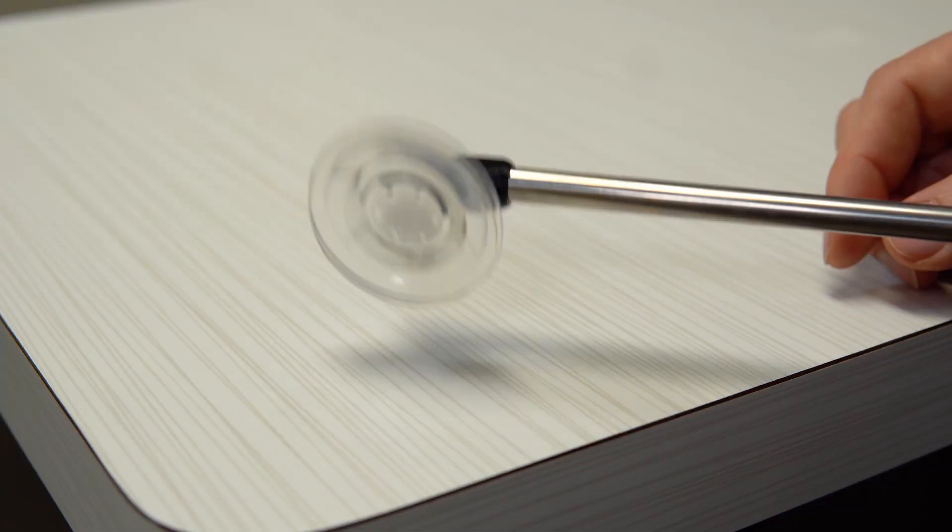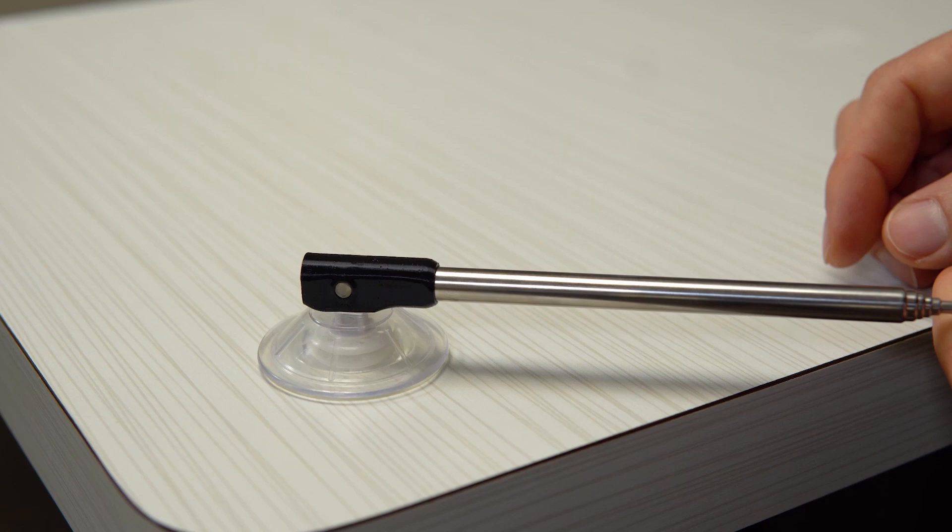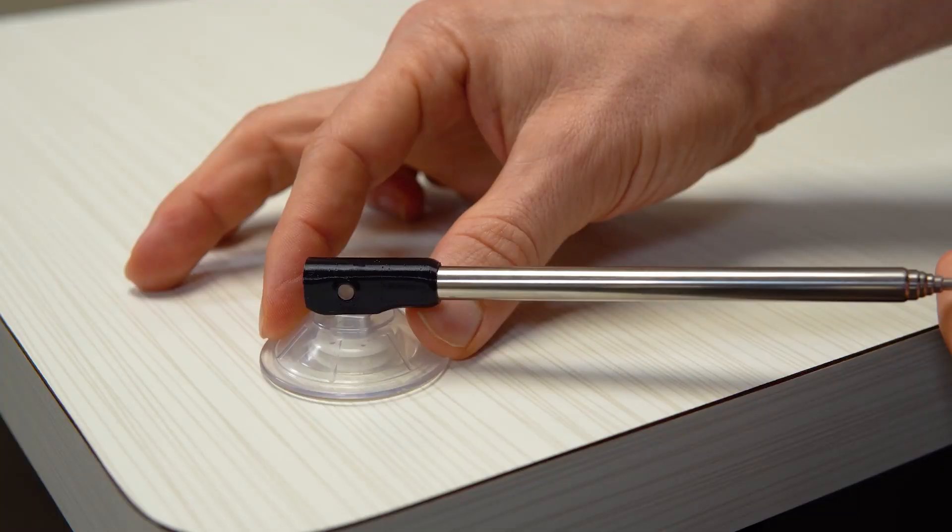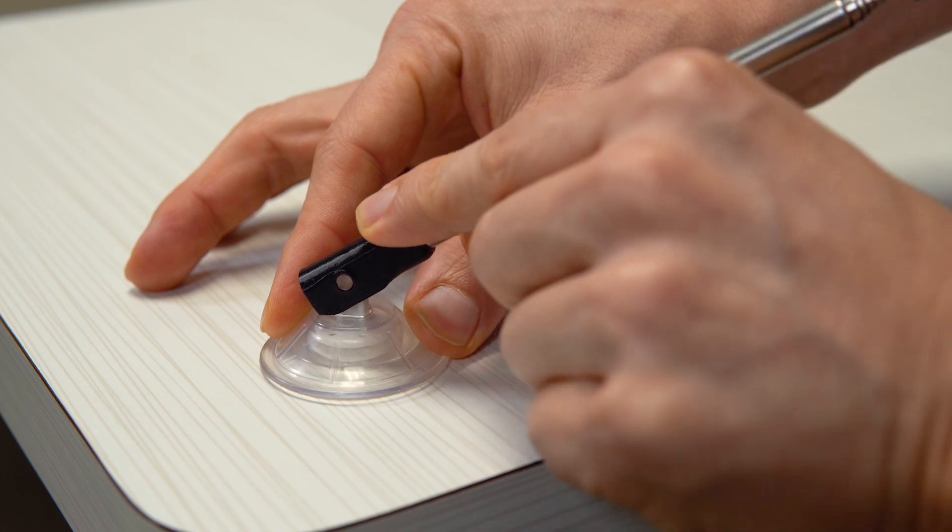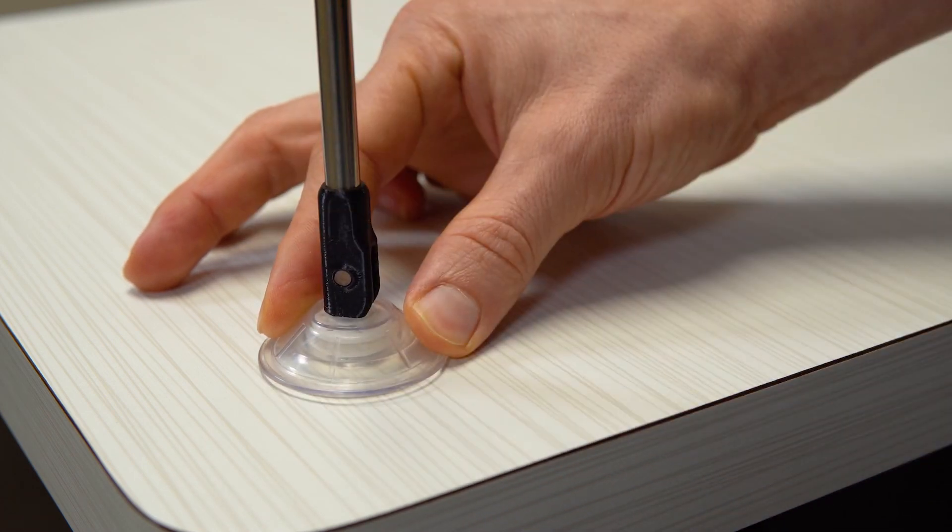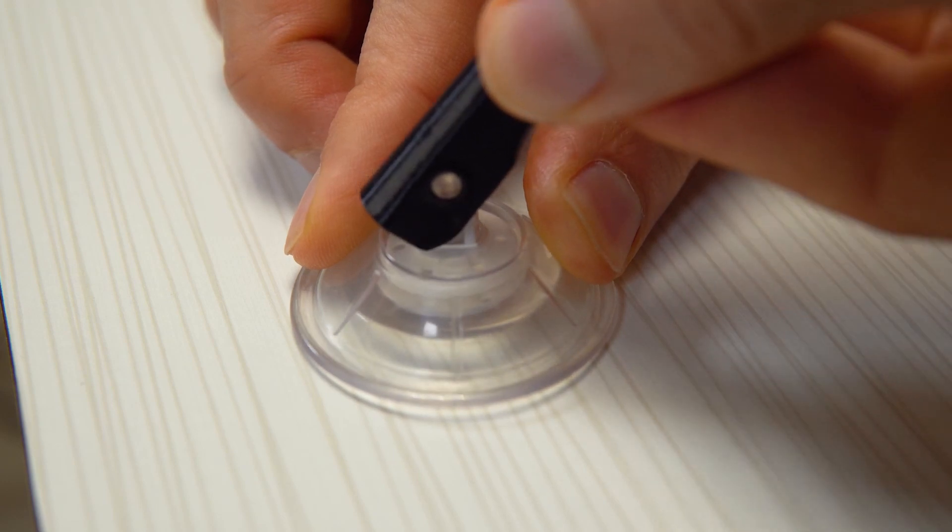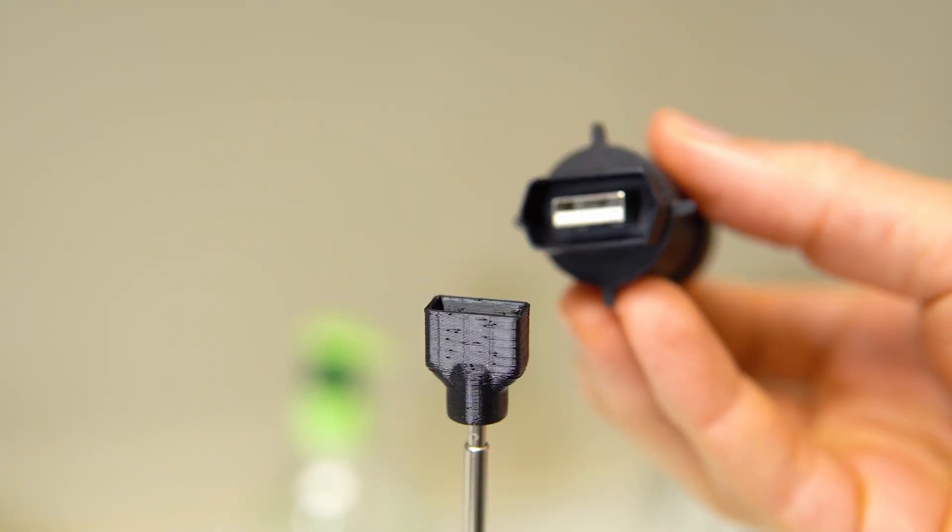Step one: place the suction base on a smooth flat surface. Step two: press down on the suction base while pulling the black base lever upward until it locks into the vertical position. This will engage the suction of the base. Step three: connect the light unit to the top of the base lever.